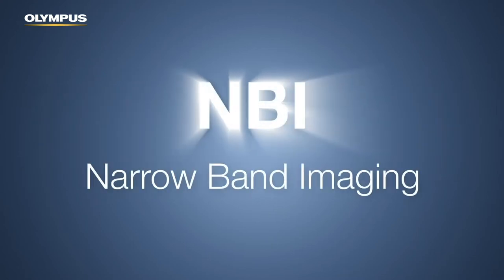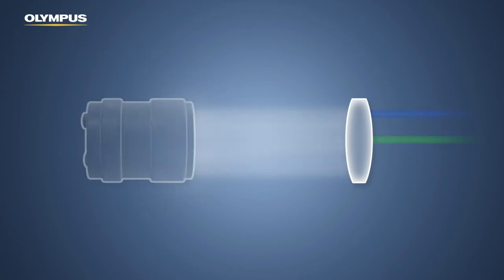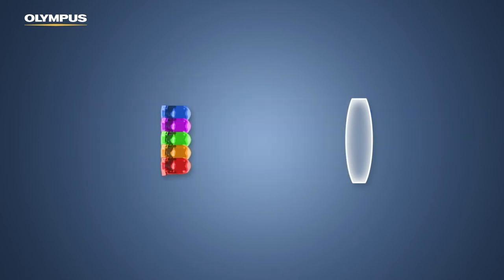NBI stands for Narrowband Imaging. In contrast to the previous series, EVS X1, NBI uses LED illumination.